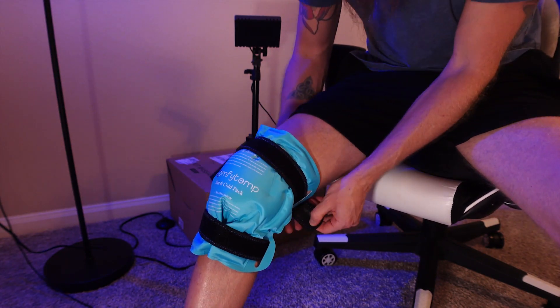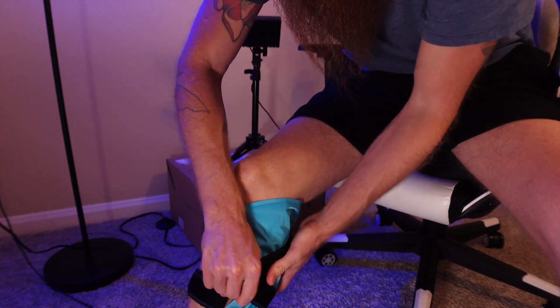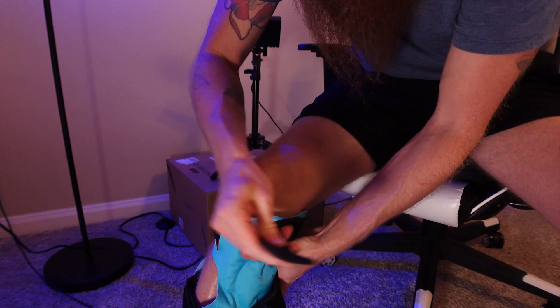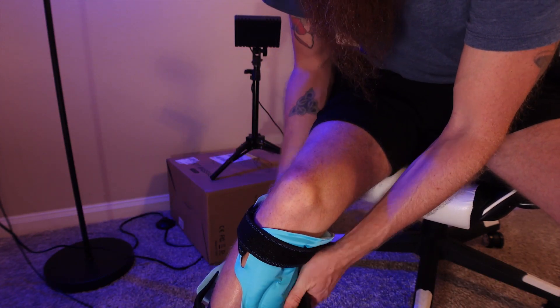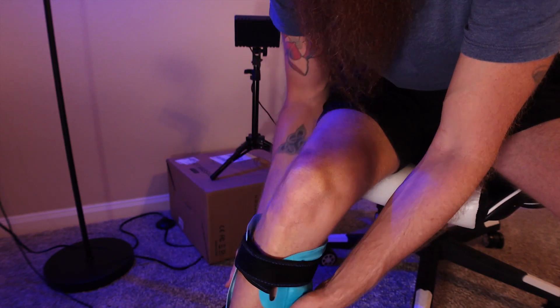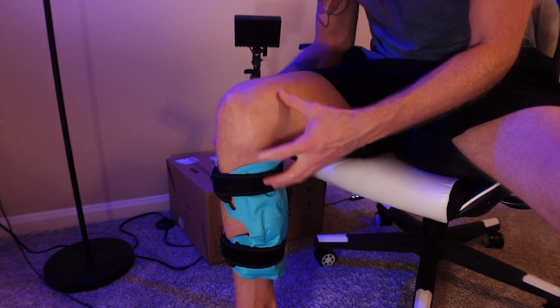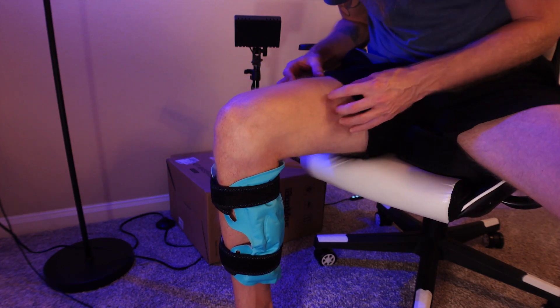It's on my knee now — you could always loosen it up and slide it down. I could put it on my calf and use it there, so it is very versatile. You can use it on your entire leg and it's large enough that it's going to fit your entire leg too.